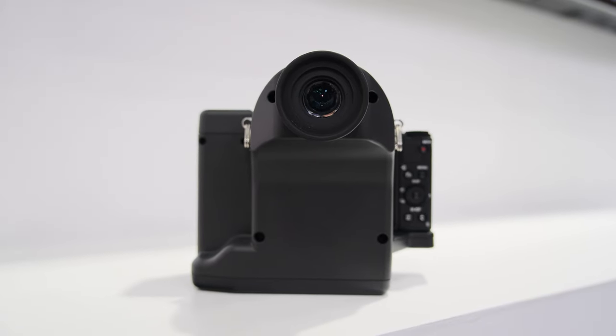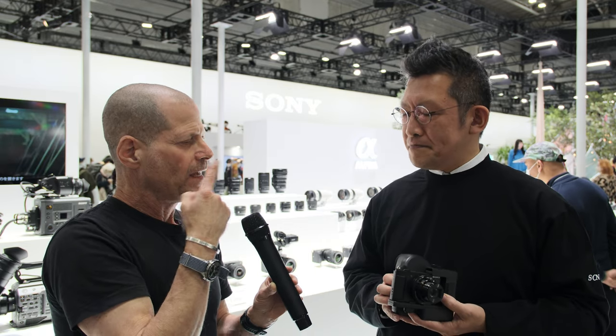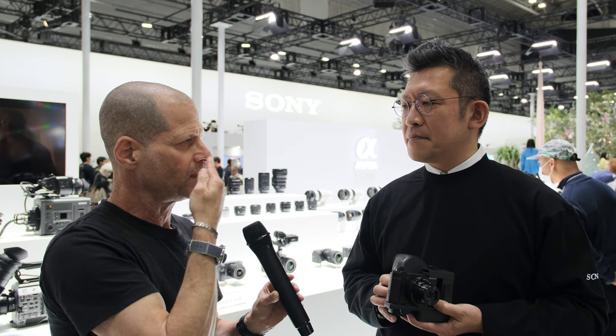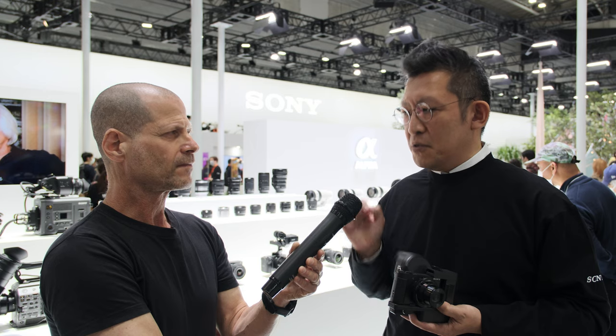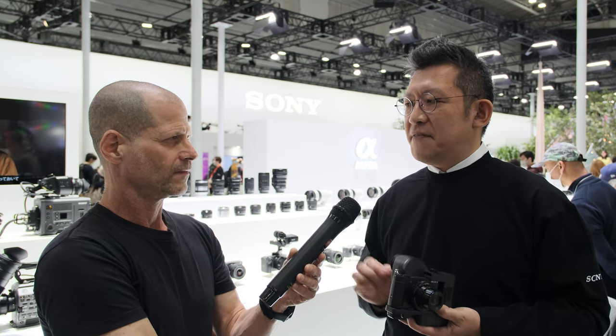That sounds amazing, because first of all you're opening the creative world to people that have some issues with eyesight. I have contact lenses and very strong astigmatism — if I want to work with this device, do I need to keep them in? Both are okay. You can see with or without your contact lenses. You just skip all the focusing function of your eye.